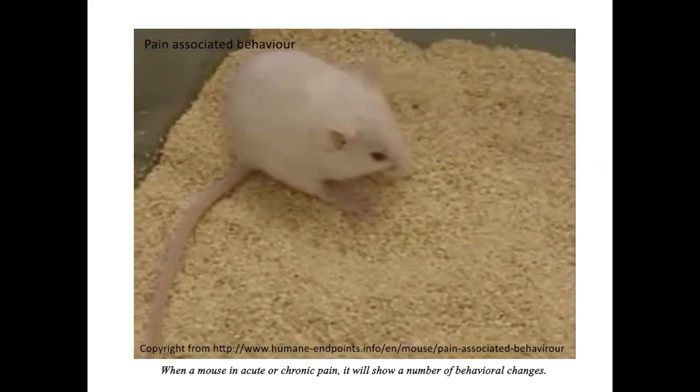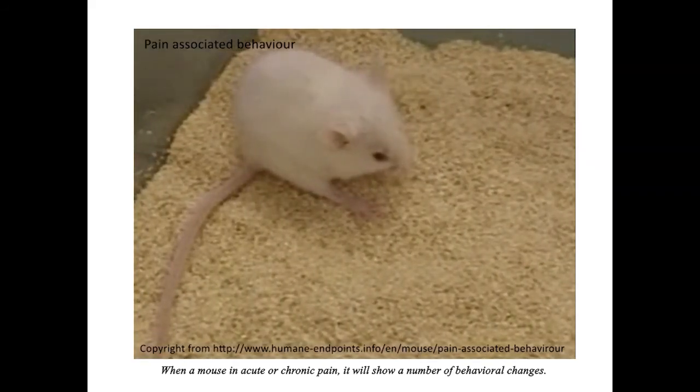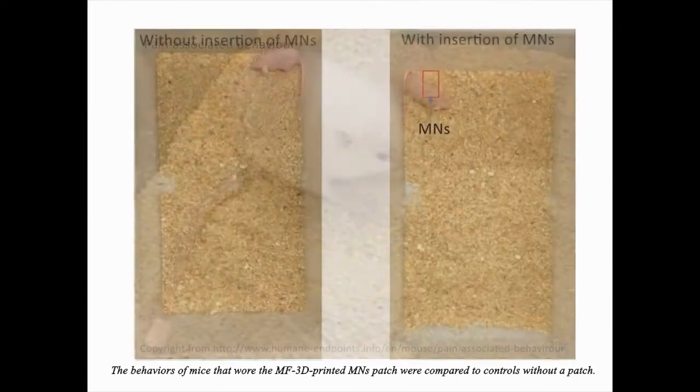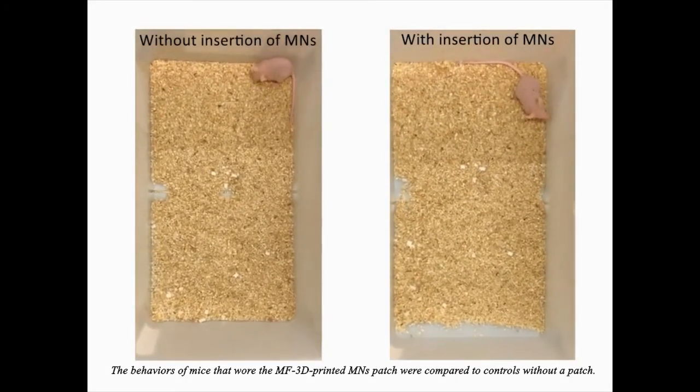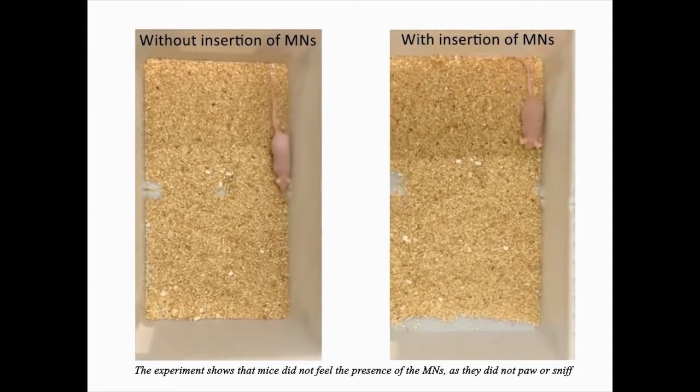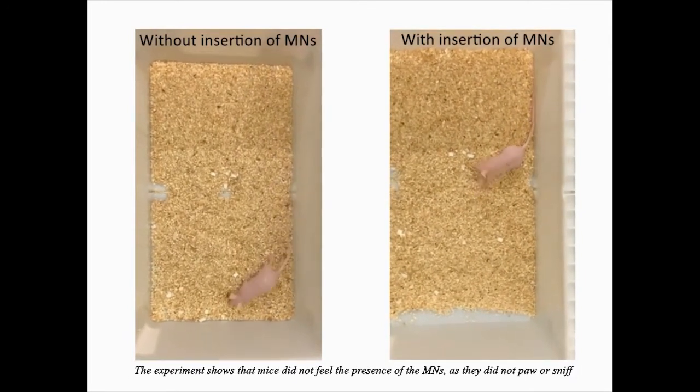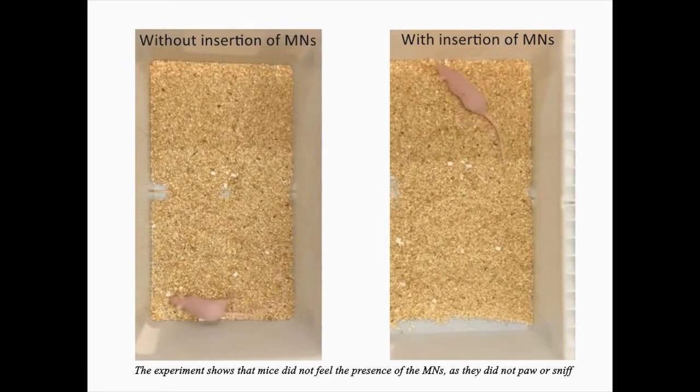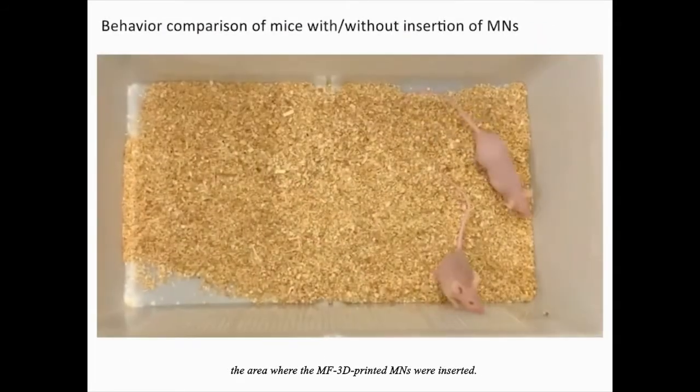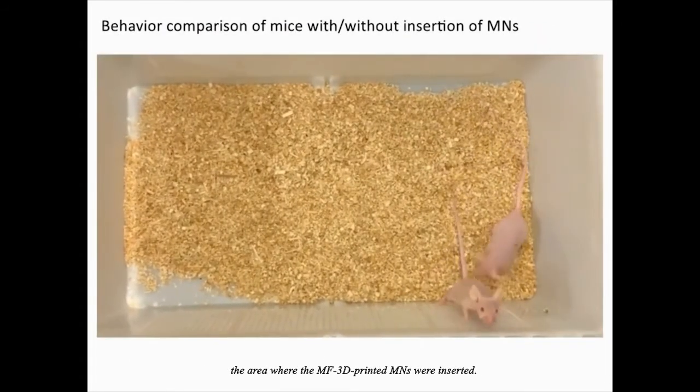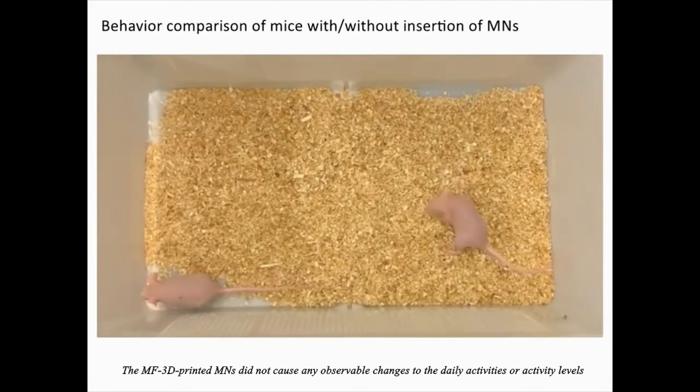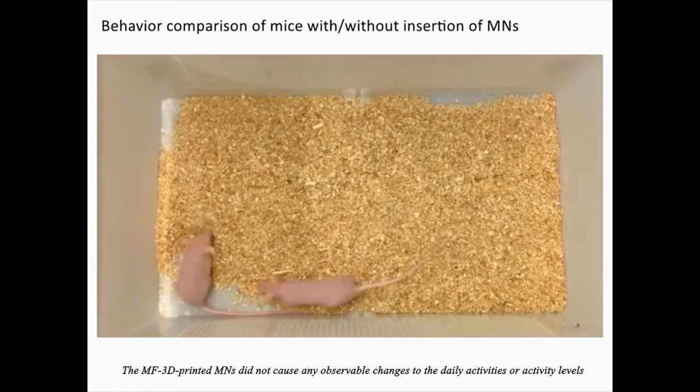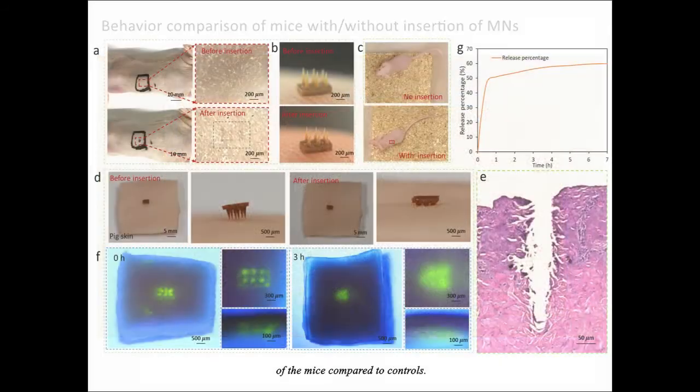When a mouse is in acute or chronic pain, it will show a number of behavioral changes. The behaviors of mice that wore the MF3DP printed microneedle patch were compared to controls without a patch. The experiment shows that mice did not feel the presence of the microneedles, as they did not paw or sniff the area where the MF3DP printed microneedles were inserted. The MF3DP printed microneedles did not cause any observable changes to the daily activities or activity levels of the mice compared to controls.